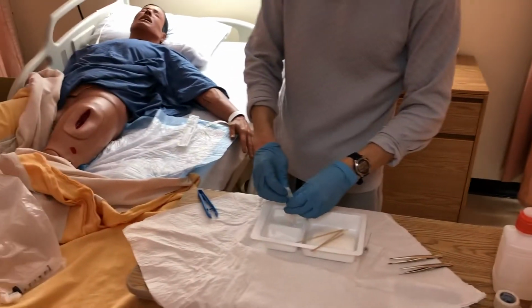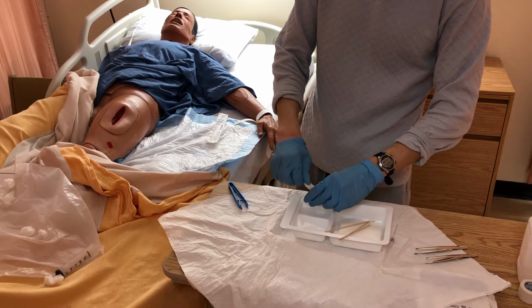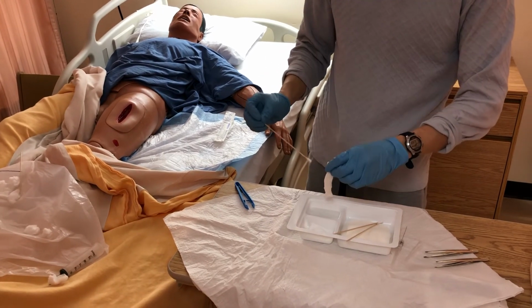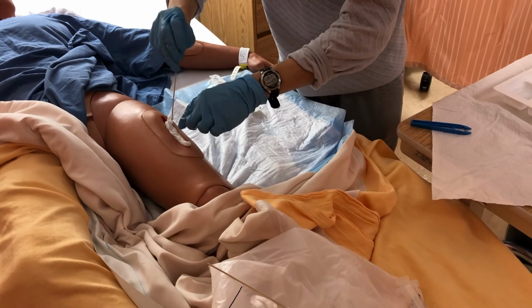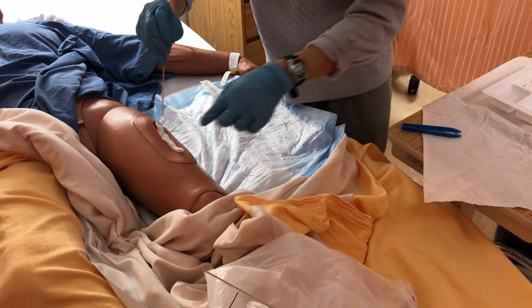And now I'm going to take out some excessive moisture. And now I'm going to take a cotton stick, and that's going to help me pack the wound. All right. And I'm packing so it's not too tight, but there's not an excessive amount of dead space either.